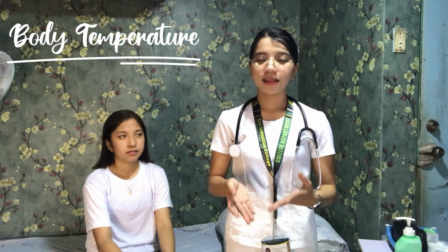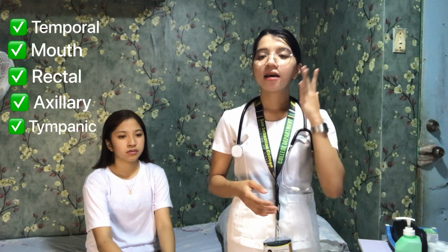Which one will we start with? Ma'am, to begin, I'm going to take your body temperature. Body temperature is significant because it reflects the body's balance of heat production and heat loss. There are a few places where we can measure body temperature, which are the temporal, the mouth, the rectal, the axillary, and the tympanic membrane. Now I'm going to measure my patient's body temperature through her axillary only.